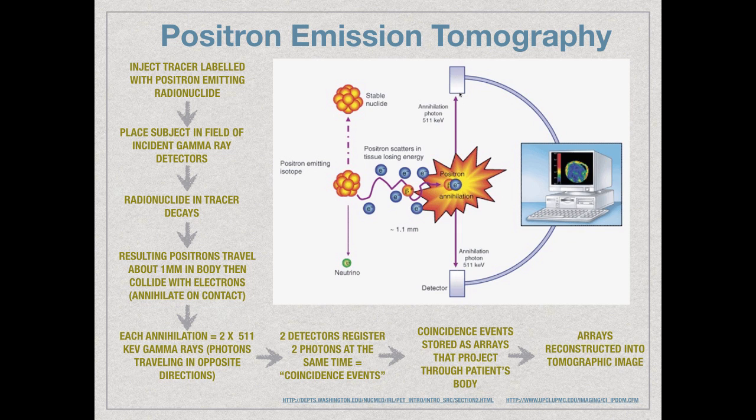And so this is why this is very sensitive, because only photons that are coincident, as it's called, at that 180 degrees, hitting the detectors in equal and opposite directions, will be picked up by the detectors and used in the algorithm. So very important key factors: coincident photons are released, and they're both at the same energy, 511 kiloelectron volts. And that is a property of all positron emitters.